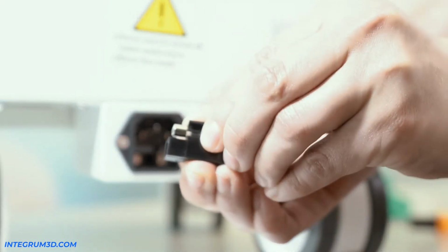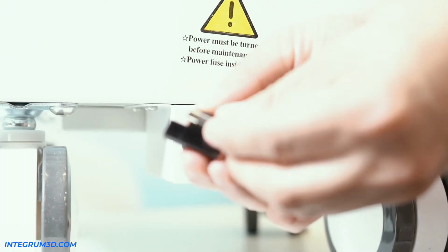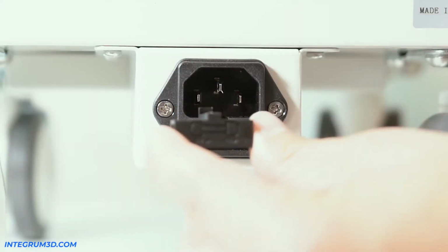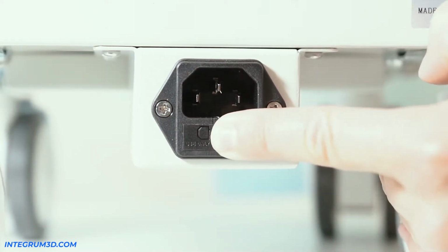You just hold the back tab, pull it out, grab your new fuse, and put it in the same exact spot and snap it inside. You're going to push it back in nice and tight in place, and push it all the way back till it clicks.